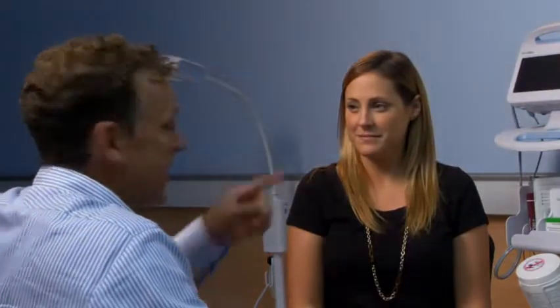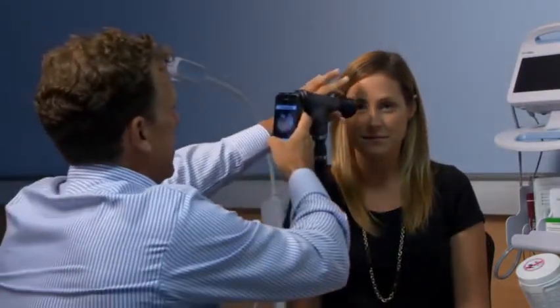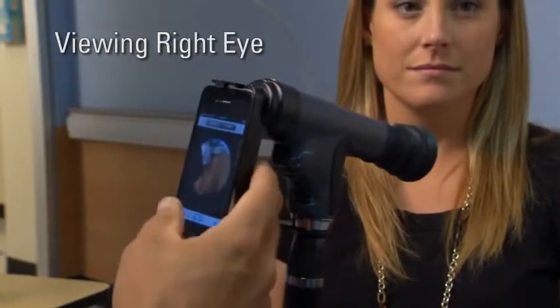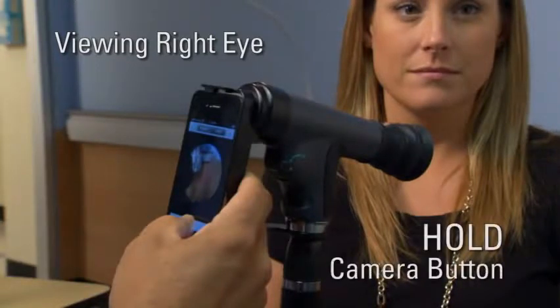For best results, use the device in a dimly lit room and try to have the patient looking towards a dark or shaded area of the room. For viewing the patient's right eye, grasp the support arm between your index and middle finger of your right hand and use your thumb to touch and hold the camera button on the iPhone screen. Don't remove your thumb until you're ready to take images.